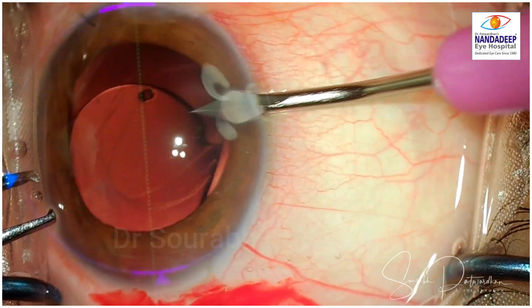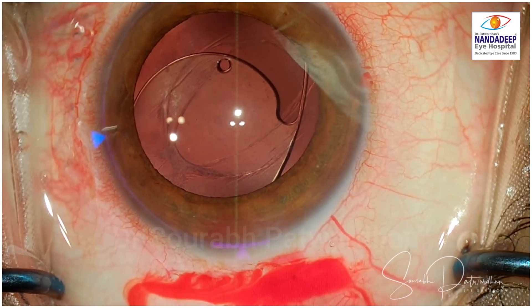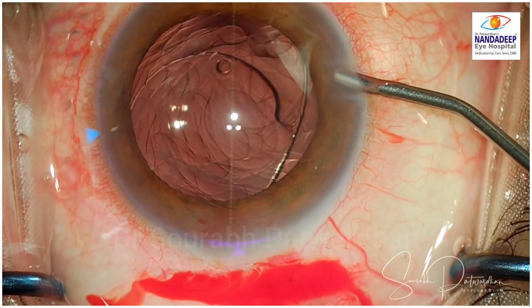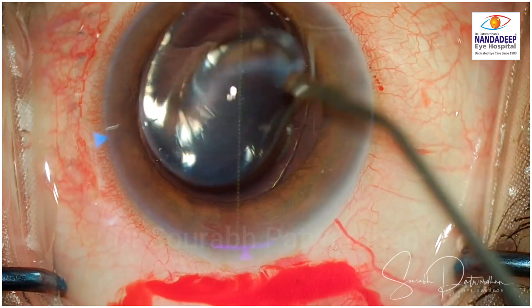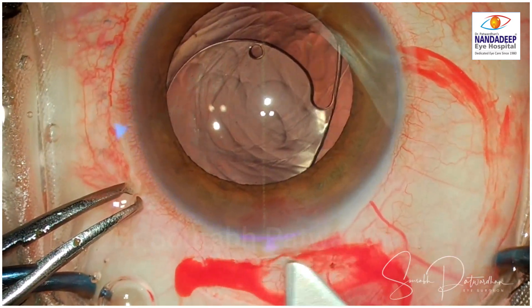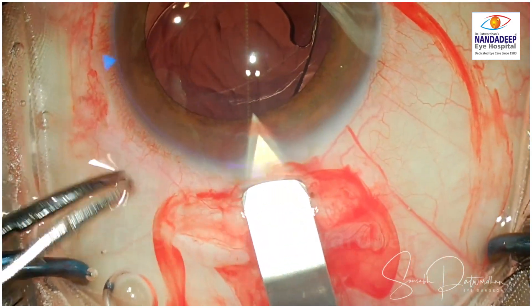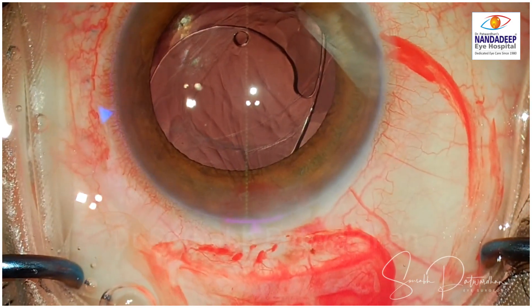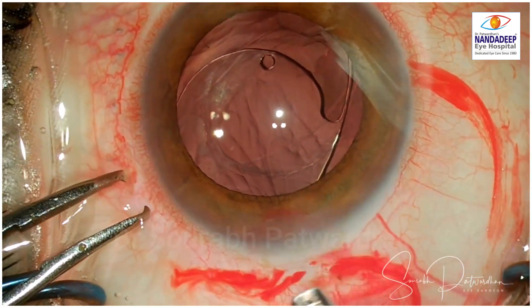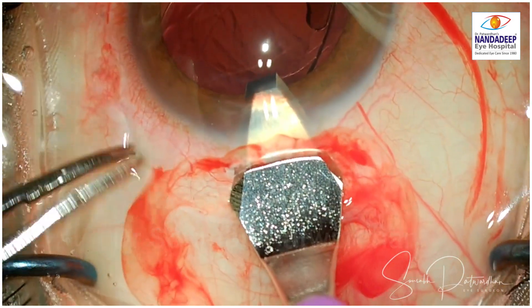A side port is made and the anterior chamber is filled with OVD 2% HPMC. Entry is now made from the temporal incision. You can see that the scleral tunnel is very close to the limbus, just 0.5 to 1mm, so it will induce some amount of with-the-rule astigmatism as it flattens the horizontal meridian.